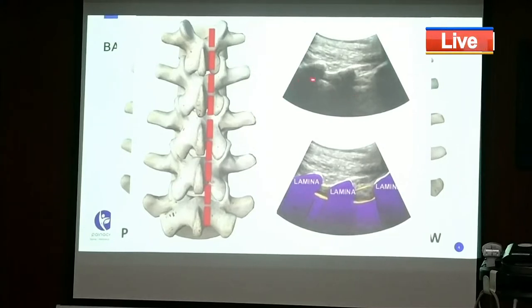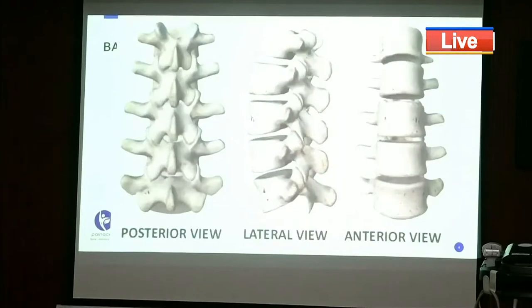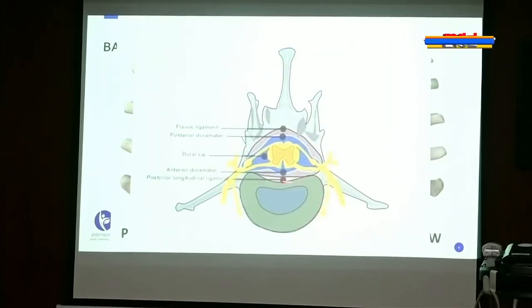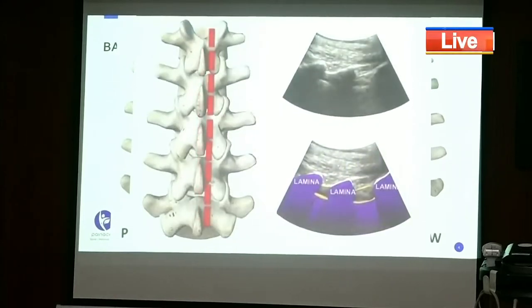Okay, so now this is the posterior vertebral margin. Remember the posterior vertebral margin, but the anterior layer which I told you. Okay, so if you've forgotten, I'll just reverse and explain this layer. Went too fast. Okay, this layer. Okay. So this is very white, shining, and hard to miss. Okay. So as soon as you move laterally, this is the thing which you are looking for.